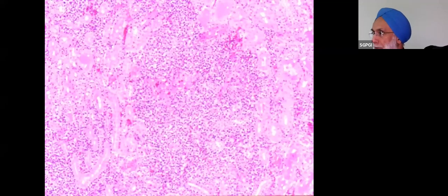So the clues that I give people is, see if the infiltrate looks nodular. You see, this looks like an expansile infiltrate. It looks like there's a clone of lymphocytes which is proliferating. So if you see this, it should cross your mind: oh, is it PTLD?